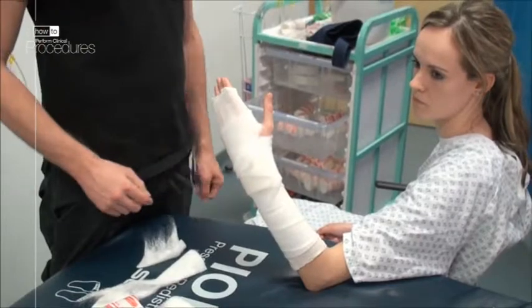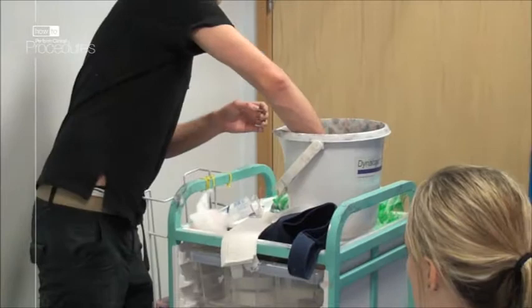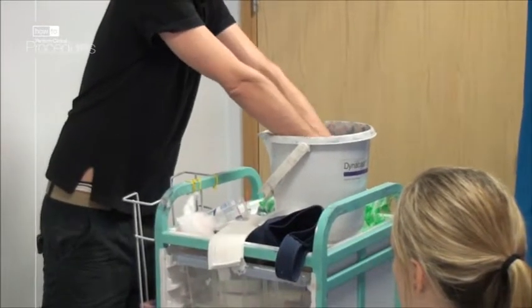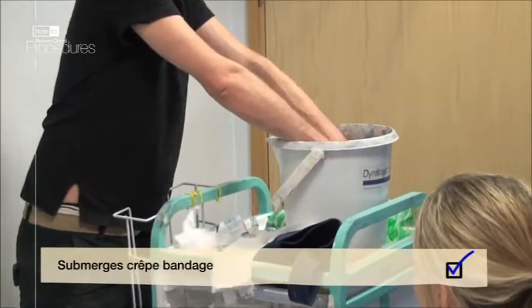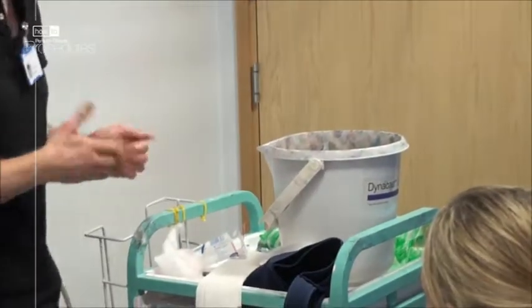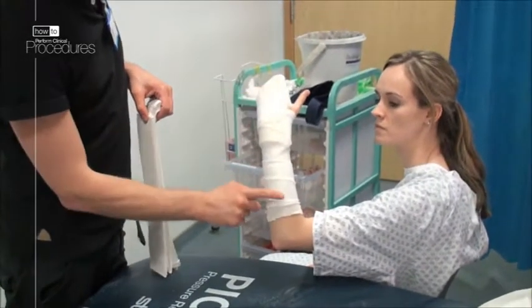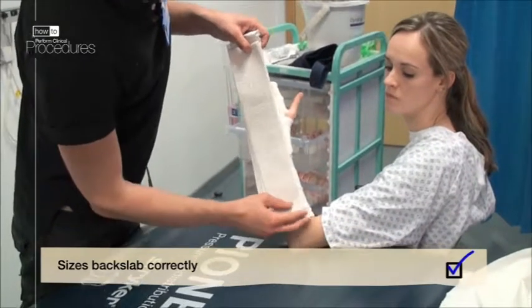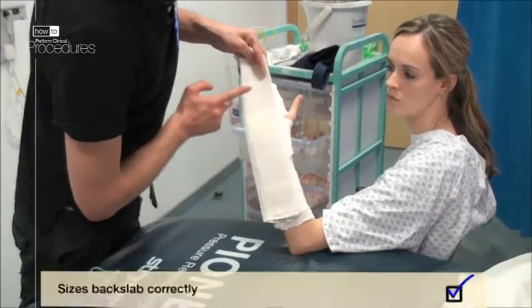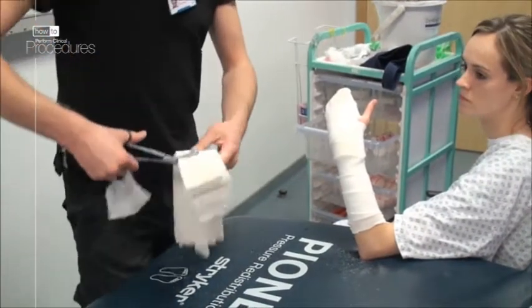Wet the crepe bandage, as this avoids any shrinking over the plaster after it has been applied to the arm. Next, we are ready to size the plaster. Remember, we want it to be slightly shorter than the stockinette and padding we have applied. Again, allow two fingers' breadth at the elbow crease to allow for articulation of the joint, and measure to the metacarpal heads.